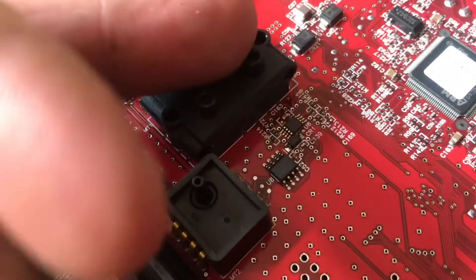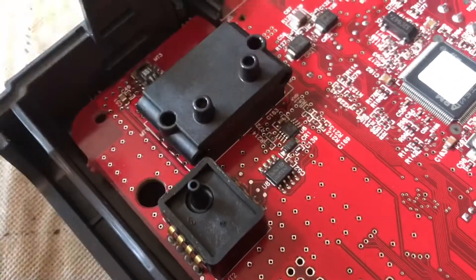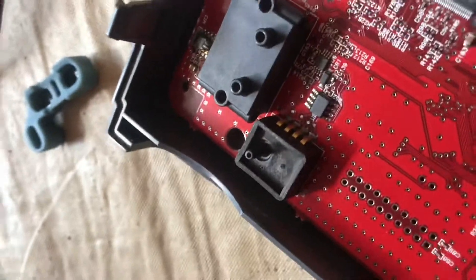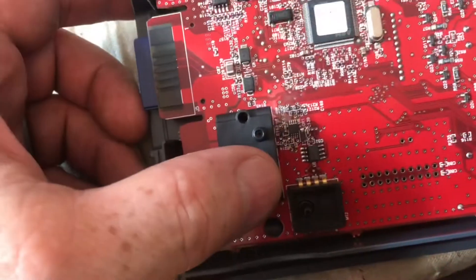You can use canned air, you can blow it out, you can use a compressor — whatever it takes to clean it up. Where these sensors connect right over here, you'll want to clean this up as well.